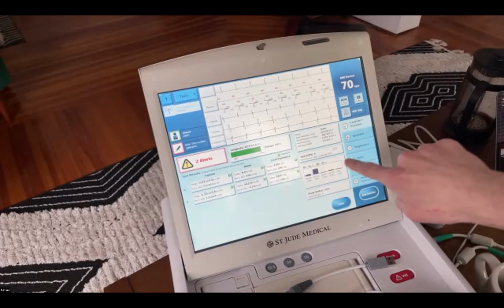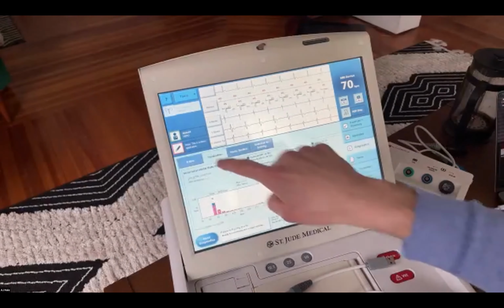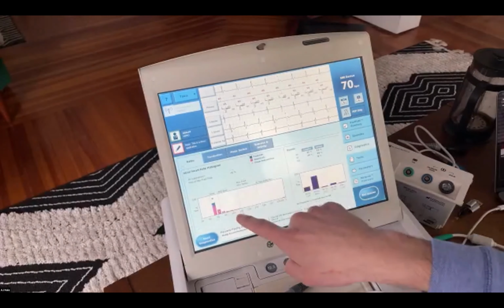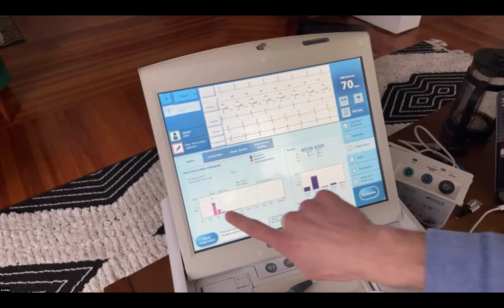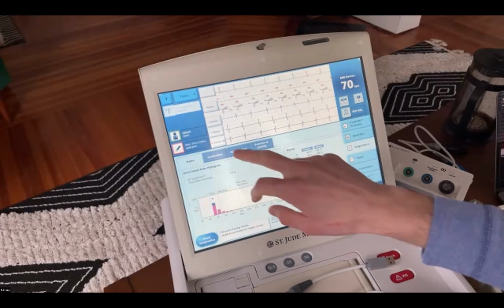If you click here or click diagnostics, it will jump to our diagnostics tab. Here you can see your atrial heart rate histograms, pacing percentages as well. Here we can see ventricular heart rate histograms. There could be differences if you're running like a DDI mode or it's at a base rate or above the max track, max sensor rate. One thing to note here is it's not monolithic. You have a nice, sweeping curve that indicates we're having good heart rate variability. If you have a very monolithic histogram here, where the patient spends all of their time at the base rate, that may indicate they may need sensor-driven rate to regulate their heart rate.